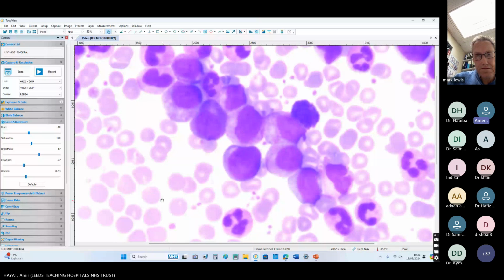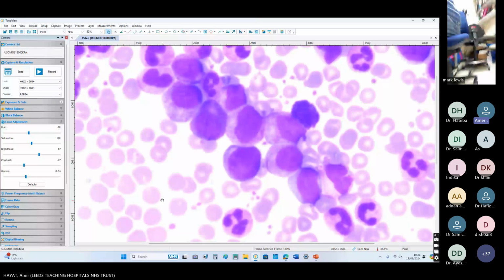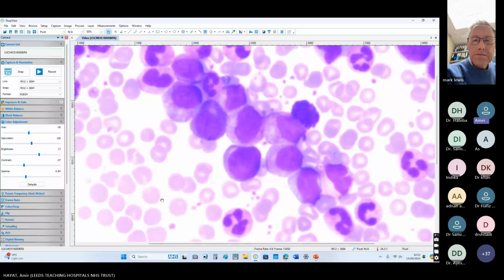And we do flow cytometry for all our leukemia cases, whether they are chronic or not chronic, just to make sure there is only one disease in this patient, which is CML. Because there are cases where we have seen CLL with a small phenotype of CML as well, or CML with a small phenotype of CLL as well. We have many patients who have dual diagnosis: CLL and CML, Waldenstrom and CLL, Waldenstrom and CML. So we do flow cytometry for all of our leukemia or lymphoma patients, just to make sure there is no dual diagnosis.